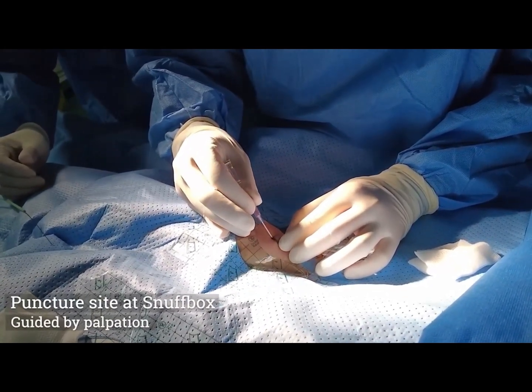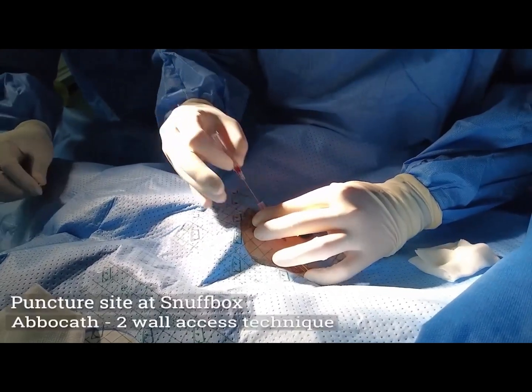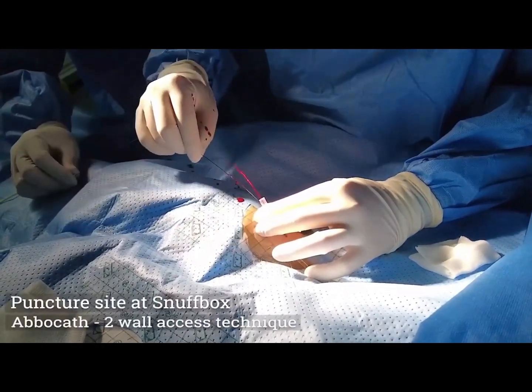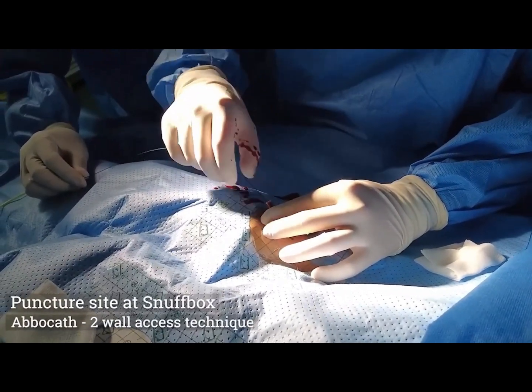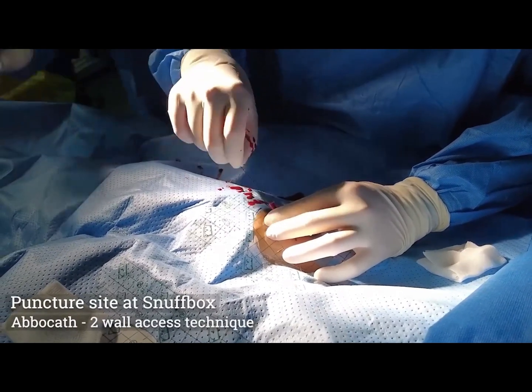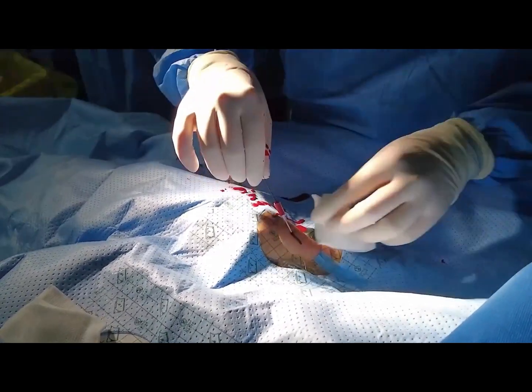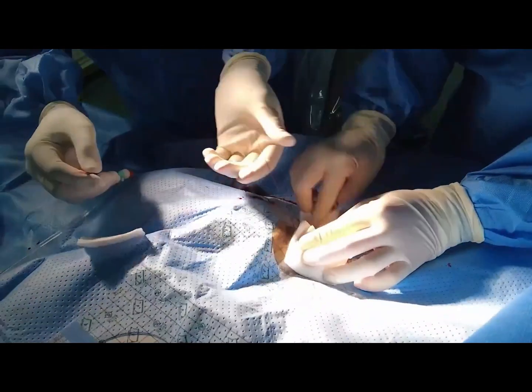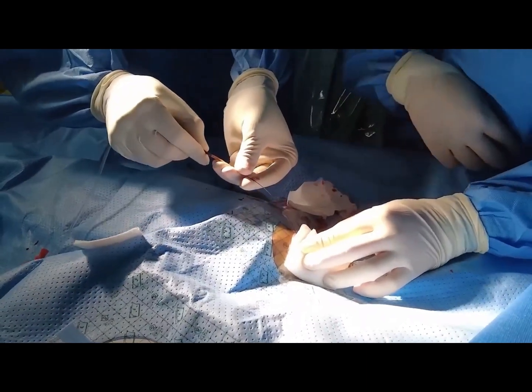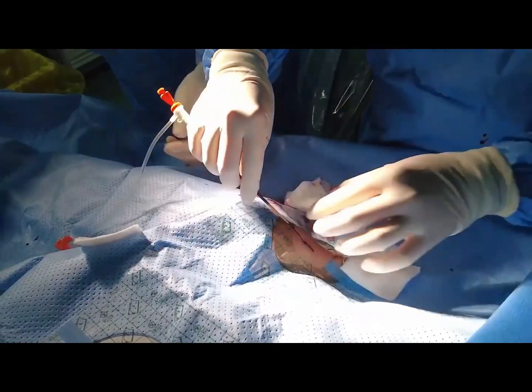Good morning, everyone. Now I'm helping you to guide this recorded live case. My name is Dilara Sate, and as you can see here, this case started with left distal radial, but actually in this presentation, it is from right distal radial, so it doesn't matter which actually. But in these complex cases, we did left distal radial with IABP.